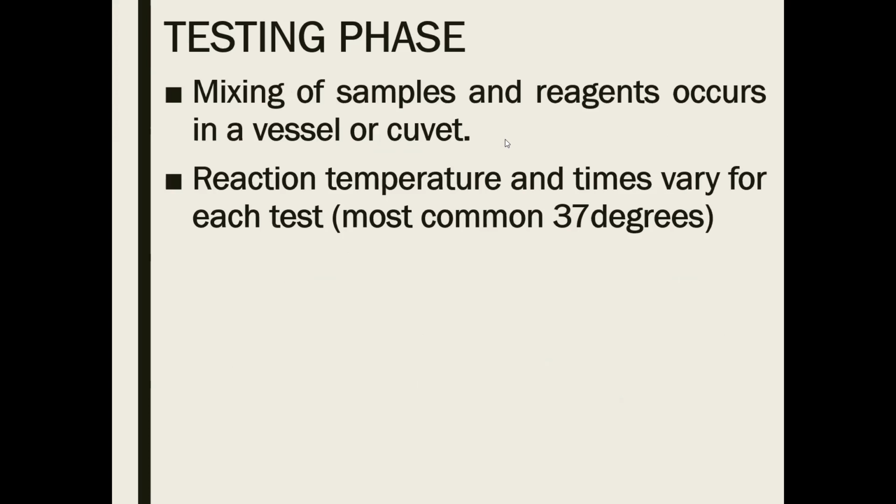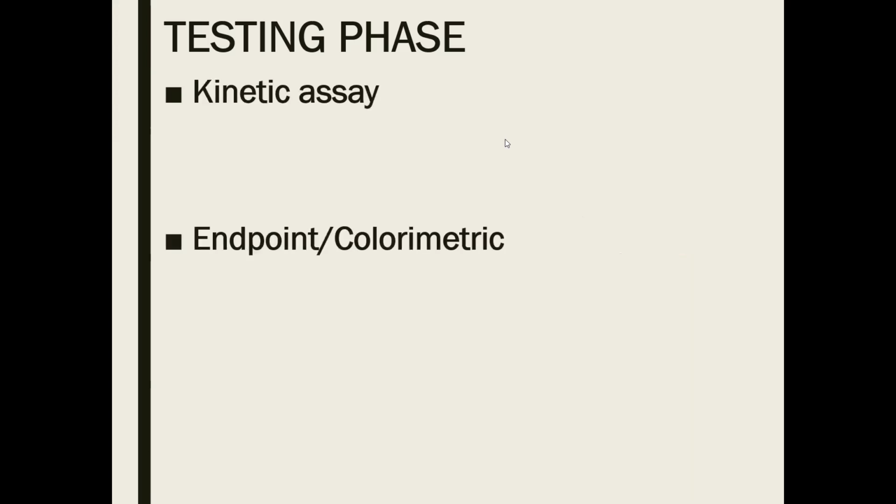Okay? When we said testing phase, the mixing of the sample and the reagent occurs in the vessel or cuvette. Pwedeng sa slide, that can be referred to as your vessel, or pwedeng sa cuvette. Reaction temperature is usually, there is a variation. Okay, commonly at 37 degrees. Bakit? Because of the body temperature. Lastly, we have your testing phase and we have your kinetic phase.